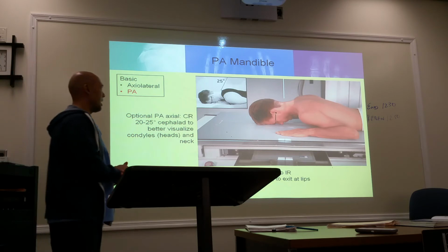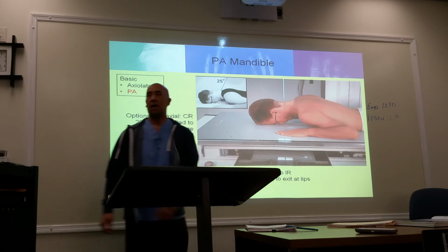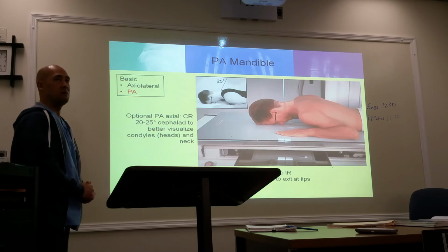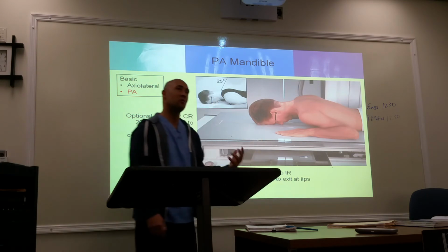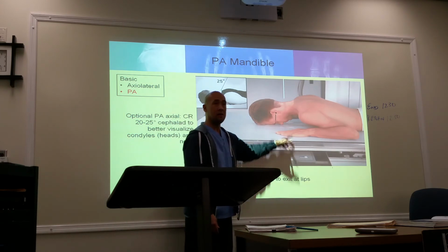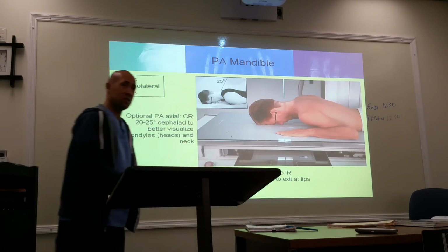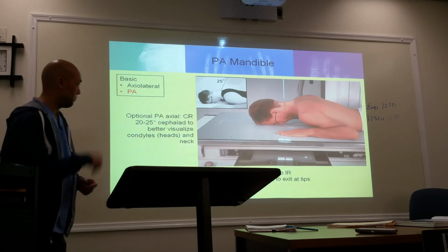In my time in radiology, this wasn't very common. This was more common. Why would we do this PA instead of AP? Magnification. I mean, we're not doing it for comfort, are we? No. Again, anytime you see positions like this, we're not doing it because of comfort. It's because we're trying to get the image receptor as close to the anatomy as best as we can. Otherwise, we have magnification. Magnification causes distortion. It can also change the degree of the resolution. Okay?